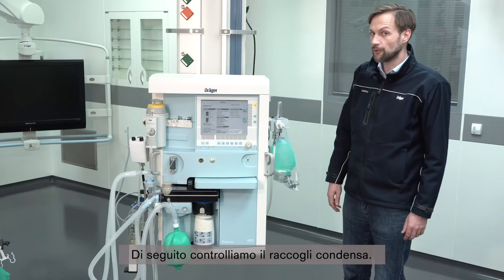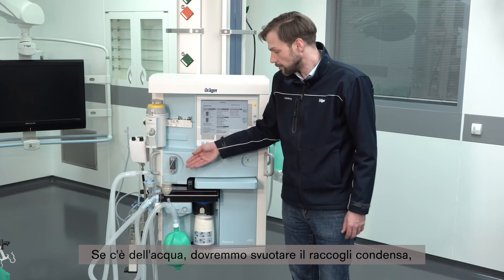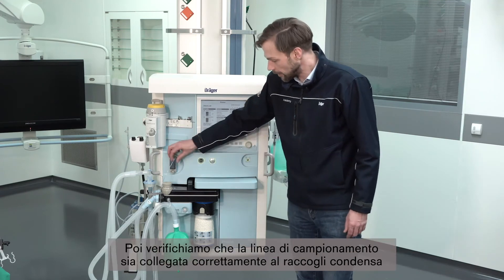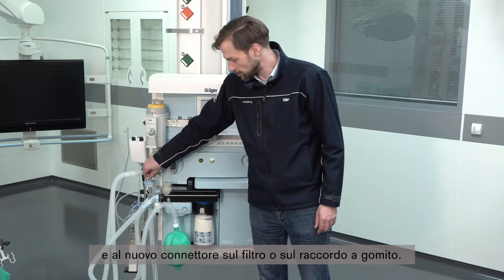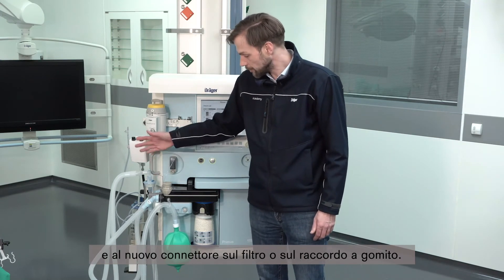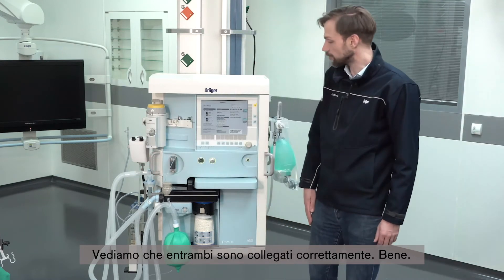Next we should check the water trap. If there is any water in the water trap, we should empty it while we have the time. Then check that the sample line is connected correctly to the water trap and to the connector on the filter or elbow, and that both are correctly connected.